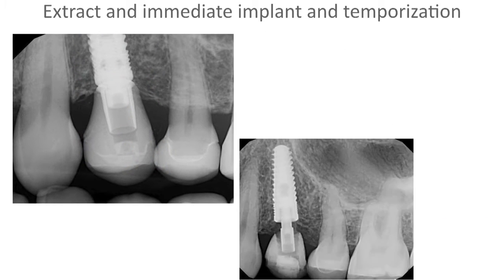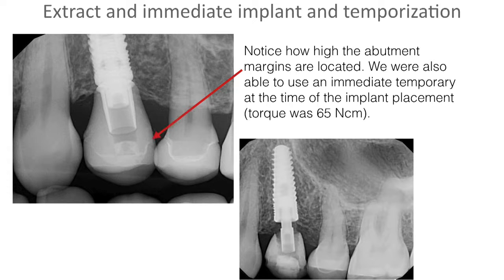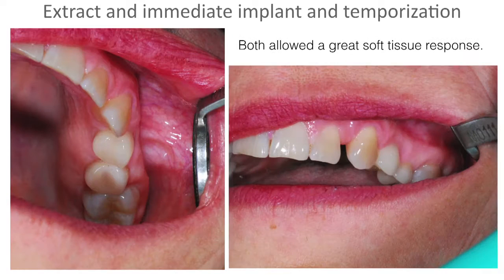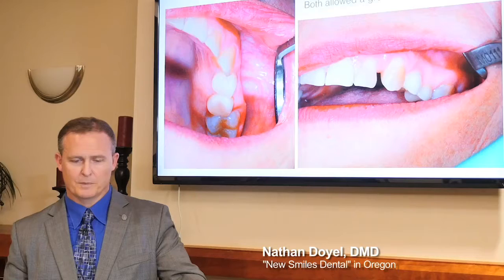Again, we were able to place it immediately because we used 65 newton centimeters of torque at the time of the placement. What we notice right here is that it looks like there's a void right there, but that plastic abutment actually doesn't show up very well on x-rays. So what you are able to see is the metal housing and the inside of the abutment. Those are great restorative options there, using the customizable plastic abutment. We have that quite a bit here at our office. Both allowed a great soft tissue response. So this is what she looked like day of restoring. It looks beautiful in pink.